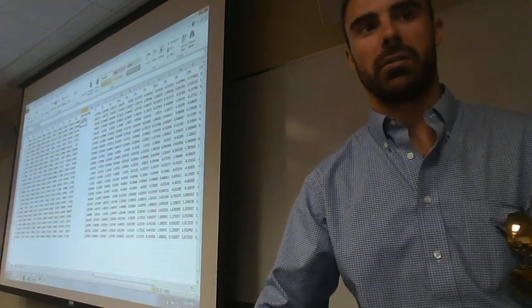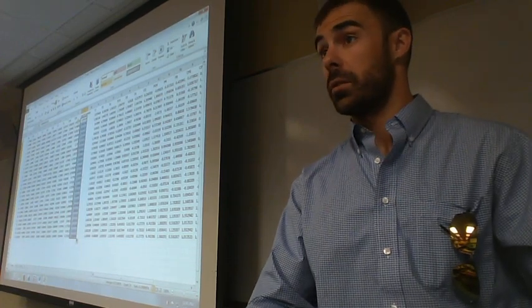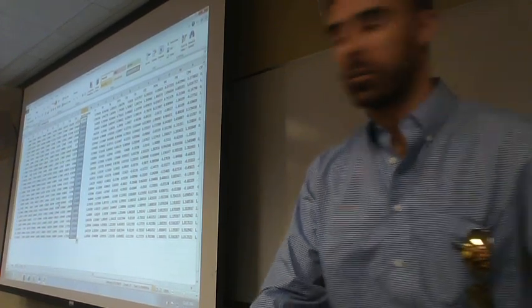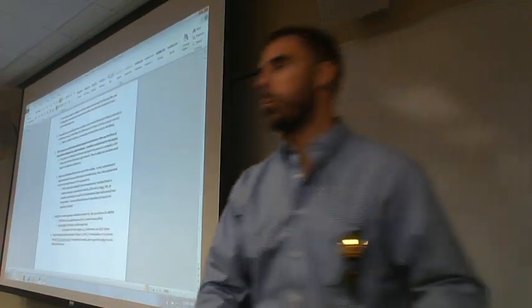You could do that if you need to, or you can run an ANOVA with those 3 levels of that left parietal thing. So now you can work with the data statistically of the mean values and run your 2x2 ANOVAs or whatever it is that you need, which is described a little bit. We don't have a lot of time left in class, but that statistical process is described now in the bottom part of our instruction.